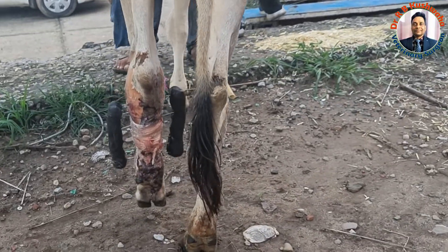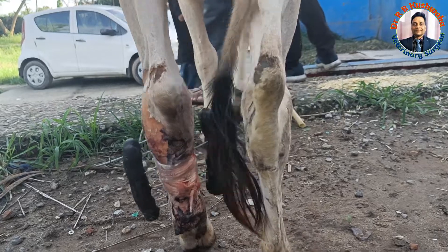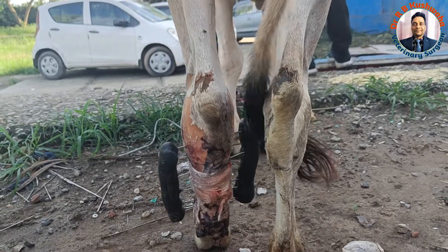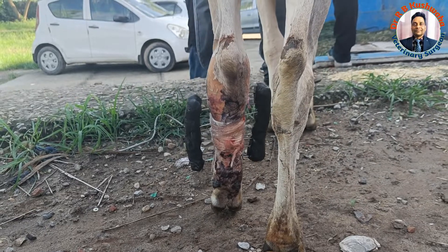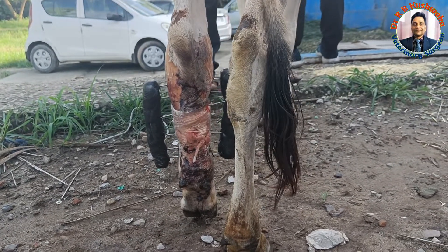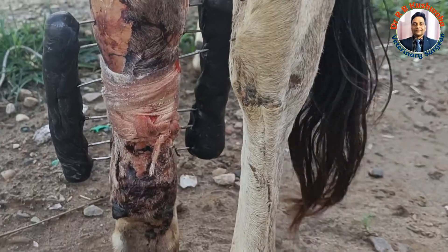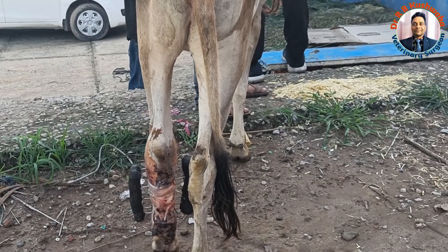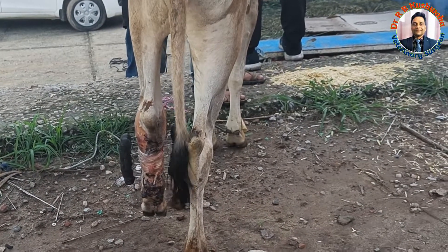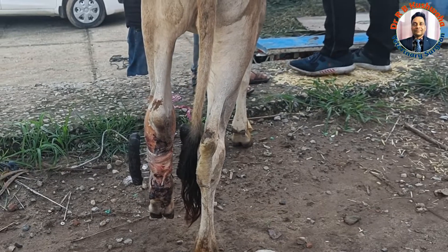I hope this animal will recover in two to three months, since this is a compound fracture we can't say the exact outcome right now. It also depends on the owner's care. We have explained all the things about the dressing of this fixator to the owner, and I hope the owner will follow all instructions and the animal will recover in a nice way.